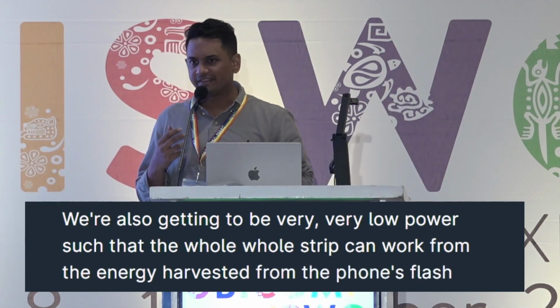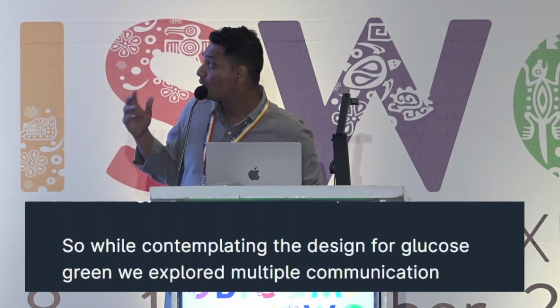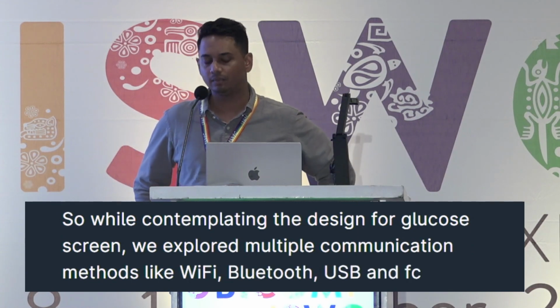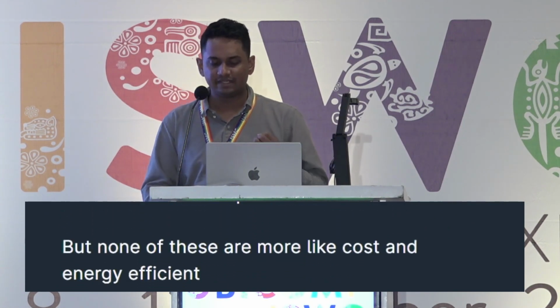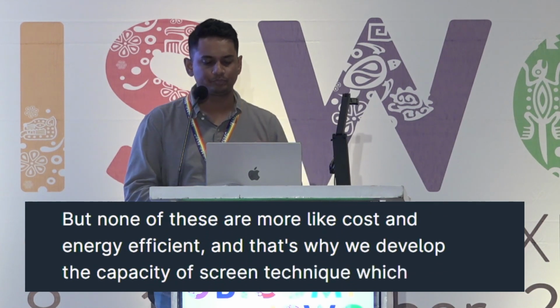While contemplating the design for GlucoScreen, we explored multiple communication methods like Wi-Fi, Bluetooth, USB, NFC, audio-based techniques, and a few more. But none of these were cost and energy efficient. That's why we developed the capacitive screen technique, which proved to be very effective.